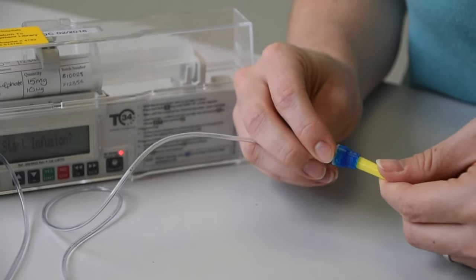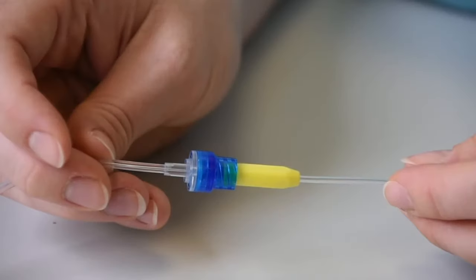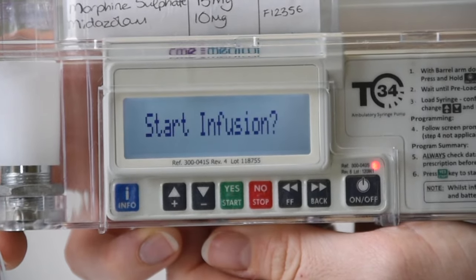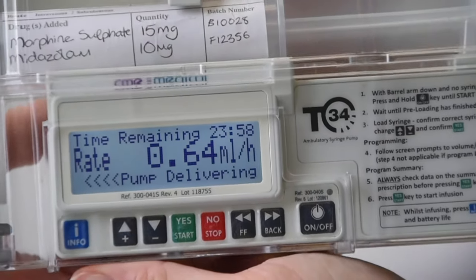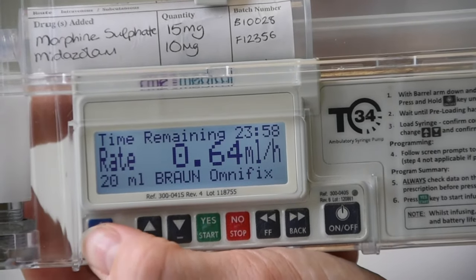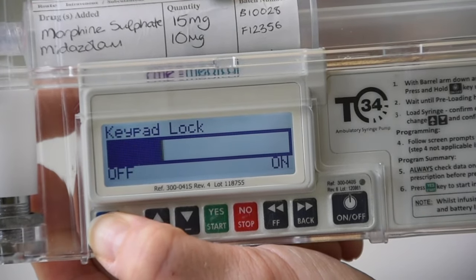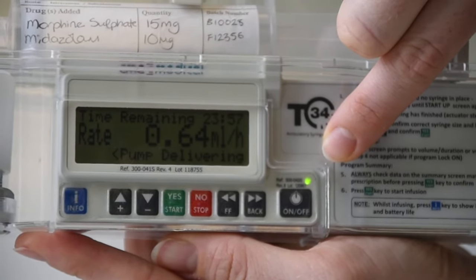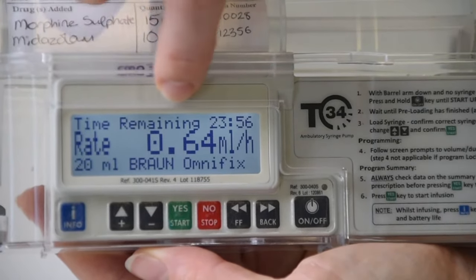And once completing identity checks, bring the pump to the patient, connect line to patient. You can then start the infusion. To lock the keypad, press and hold the info button until it beeps. Ensure the green light flashes and the main screen says pump delivering.